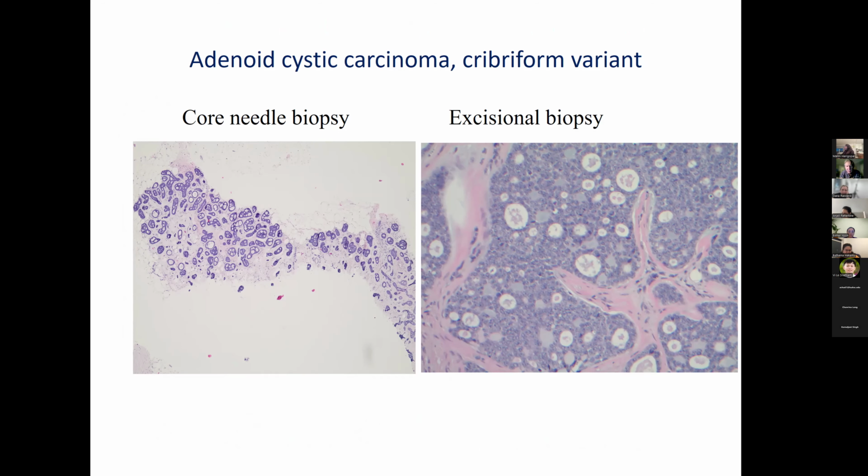Absolutely, yeah, that is in the differential diagnosis, but collagenous spherulosis will not form a mass, whereas adenoid cystic does. It's more like an incidental finding where you see it with a sclerosing lesion. And they can stain the same way. So basically, collagenous spherulosis is more of a clinical diagnosis: it's mass forming versus not mass forming, whereas adenoid cystic forms a mass. The staining pattern can be the same. They can also be SOX10 positive, like adenoid cystic carcinomas. Wow.